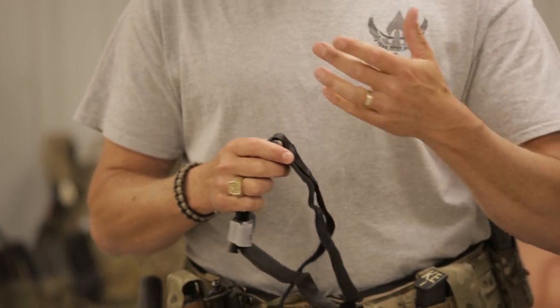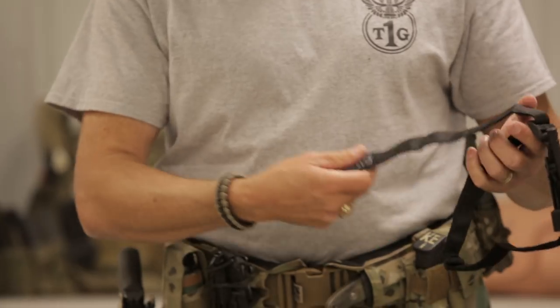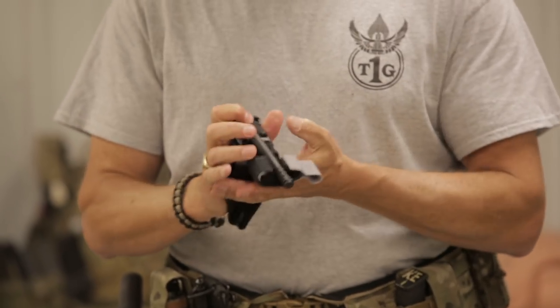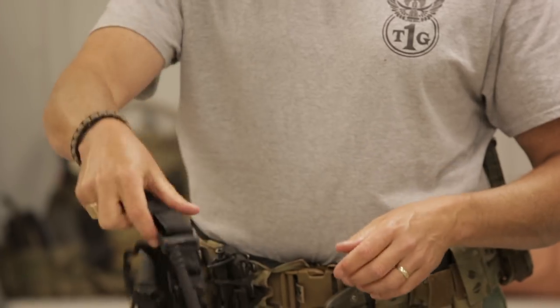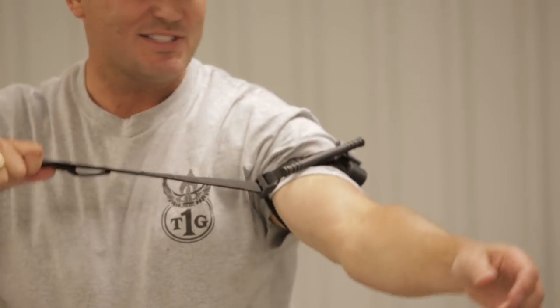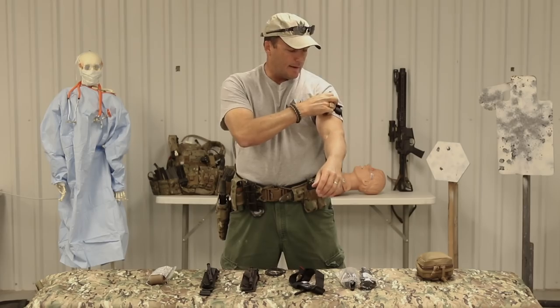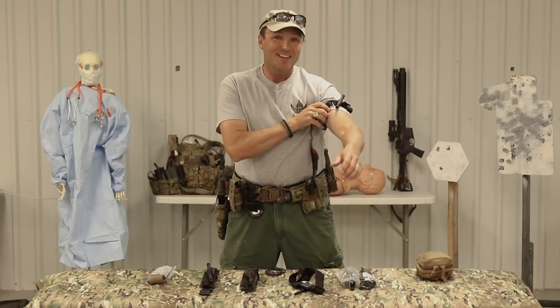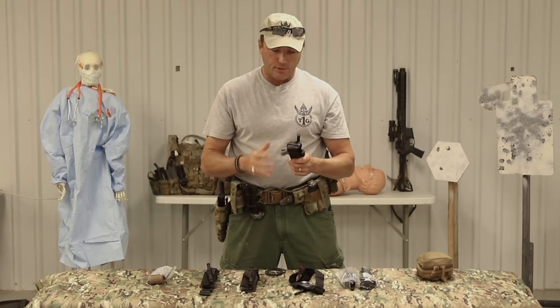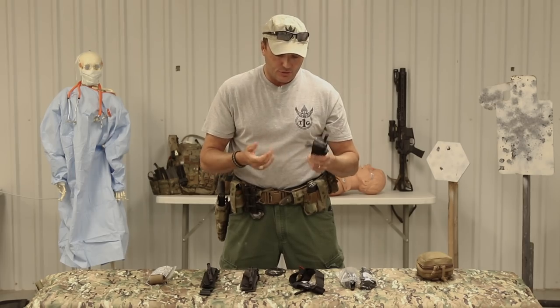The reason I prefer the new CAT for self-aid: when you set it up, take it out of the plastic and make yourself a big buddy tab on it. When you have it folded up and you take it off your kit, it'll drop open. You slide it up over the limb, pull it once, and it cinches down nice and tight. Fold it over and start tightening it up - it's that simple. You can't do that with the SOF-T tourniquet. So for self-aid, if you have to pick one tourniquet to use on yourself, I recommend the CAT-T. They've beefed up the weak points and it's a good tourniquet.